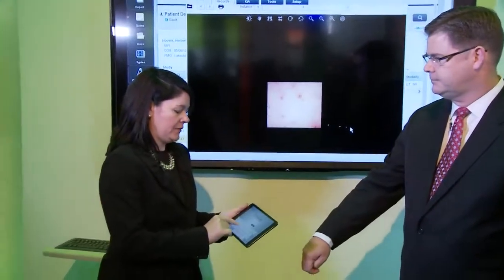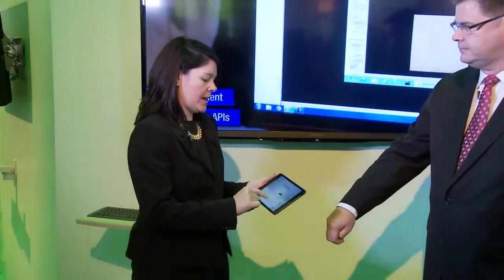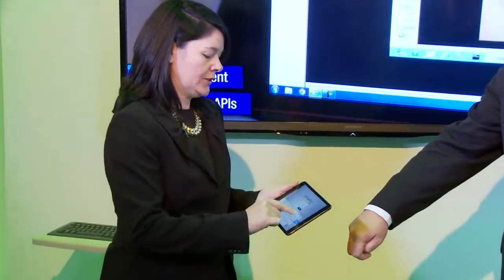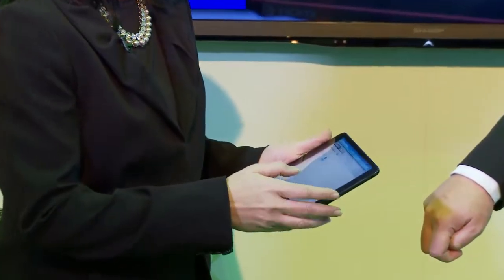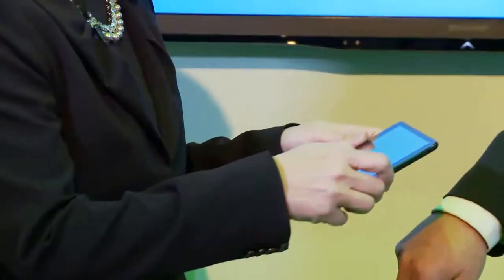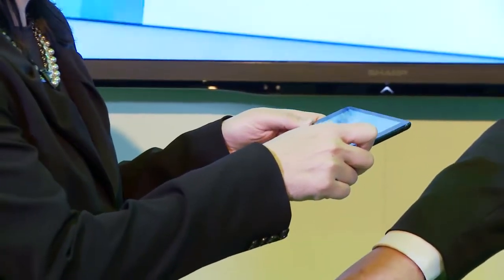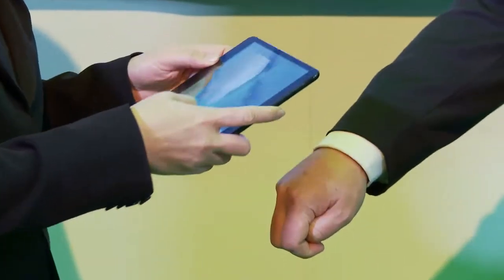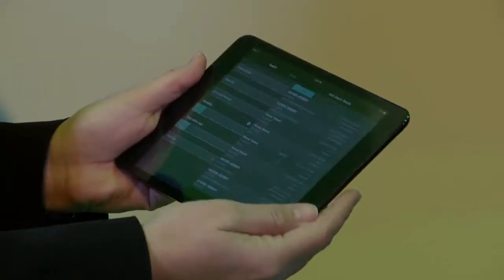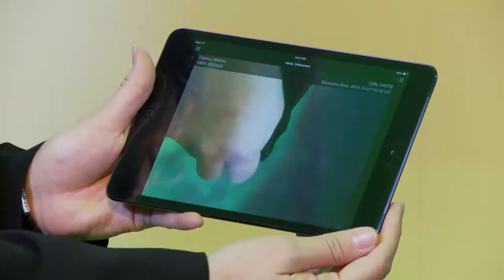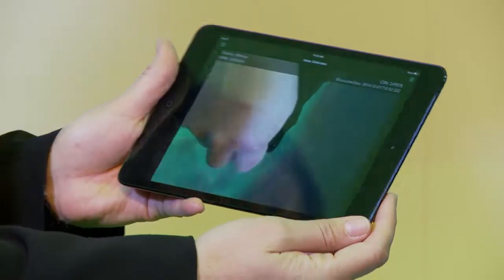So with our Synapse V&A Connects app, we're able to do real-time image capture and upload to our Synapse V&A. At this point I'm going to go ahead and capture an image of Bill's hand and upload it directly to our V&A. By logging in and selecting the patient that I just uploaded, I'm able to display that image immediately from our Synapse Mobility application.